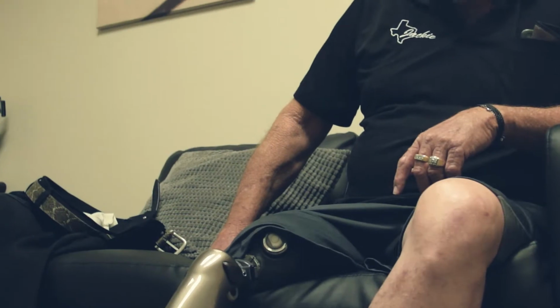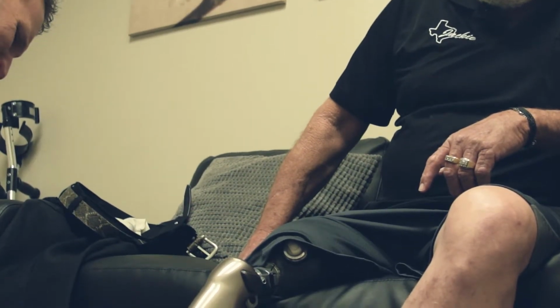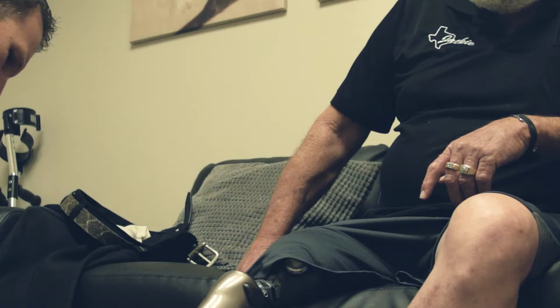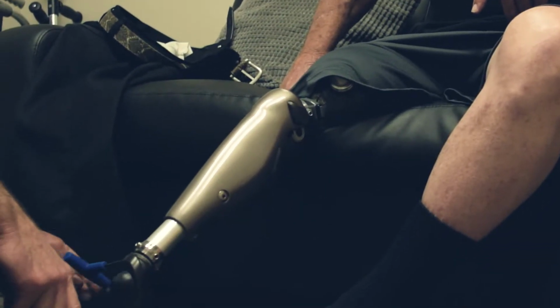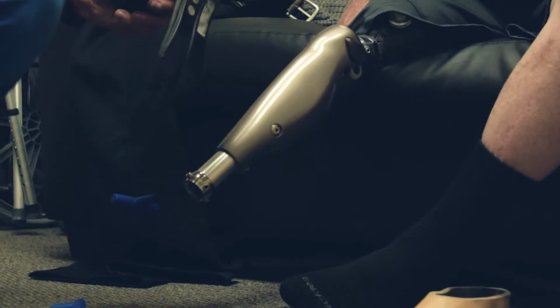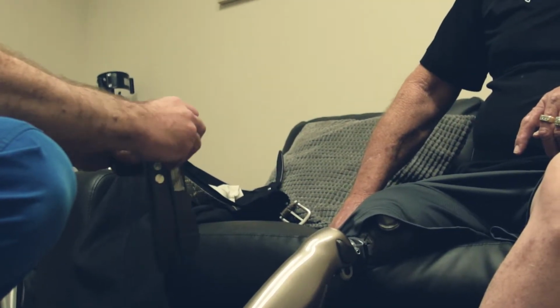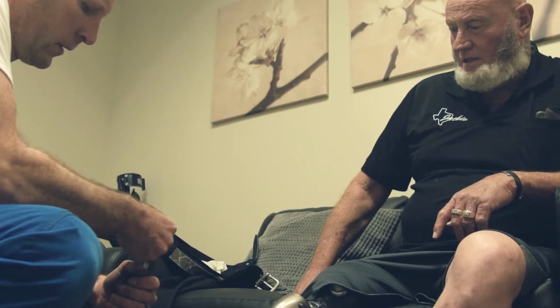All righty, let me take a look here. What I'm gonna go do, steal your foot for a second. See all the black on my hands? That's the carbon fiber wearing off. That's what that foot is made out of. It's all carbon fiber? Yep, all carbon fiber. So that carbon fiber is all wearing down and just becoming dust. And eventually it's gonna get so weak that it can snap. But I see plenty of life still left in it, so you're good. Oh man.